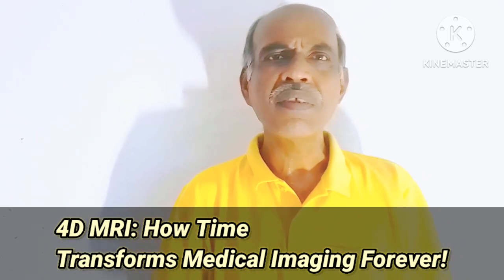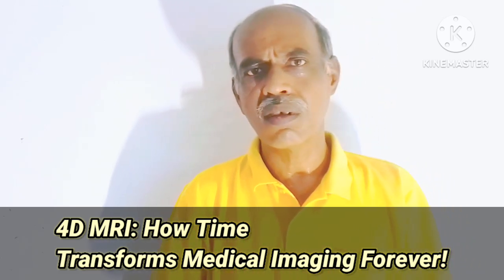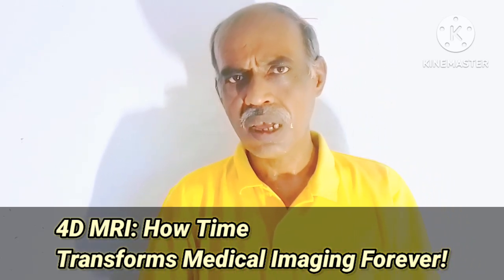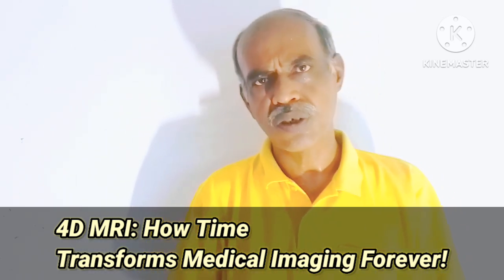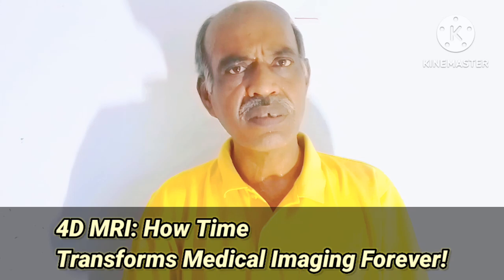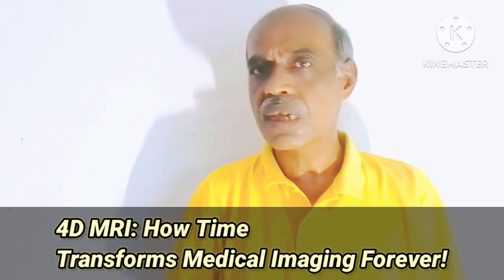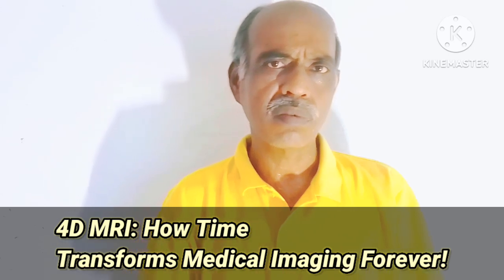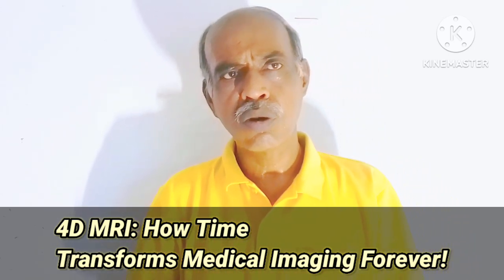Okay, so in the case of 4D MRI, first 3D scans are done and that volumetric data is collected. The patient is kept inside the MRI machine, where a strong magnetic field is present.